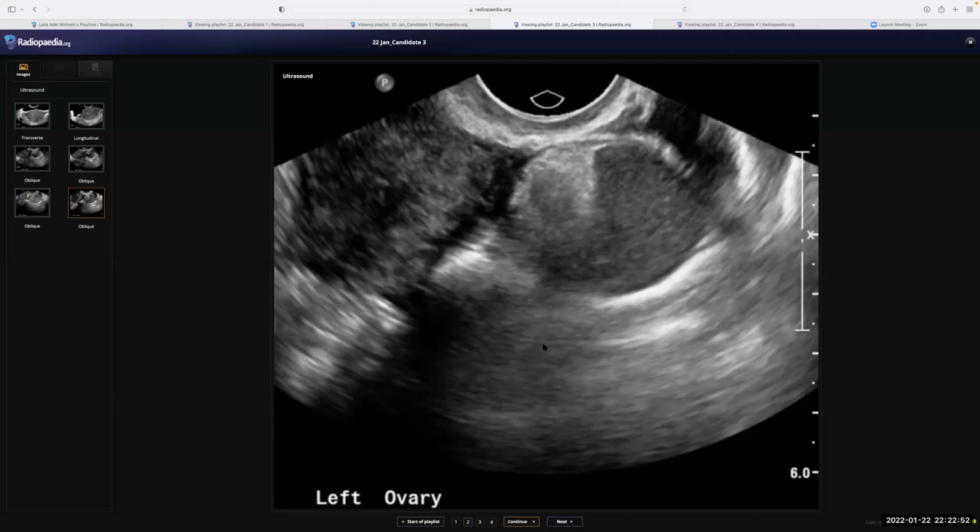However, ectopic pregnancy is another possibility, or pelvic inflammatory disease in the pelvis. So this is also a possibility. Okay, so the patient's inflammatory markers were normal, and the pain was not so acute; it's been happening over the past week or so, maybe more. Okay, so long-standing pain.